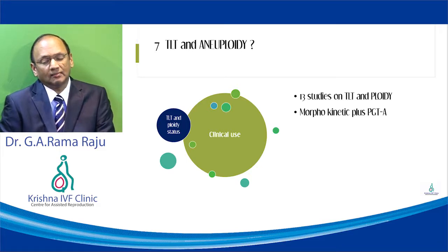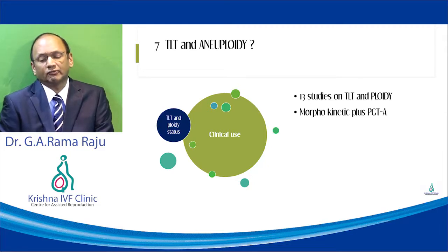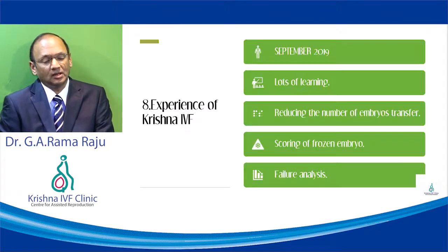The other area is non-invasive pre-implantation genetic screening combined with morphokinetics or time-lapse technology, which are the future steps coming in the next 1 or 2 years.